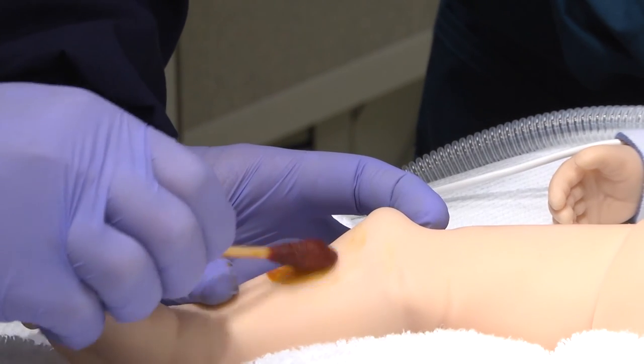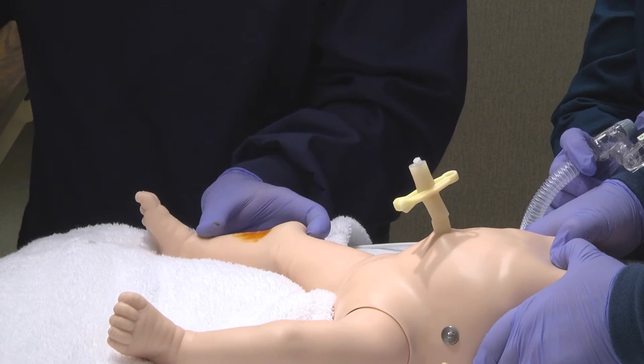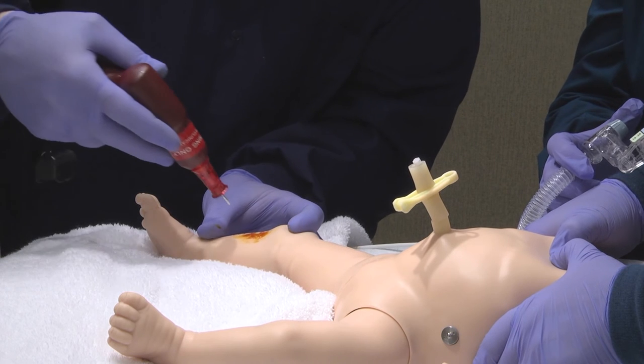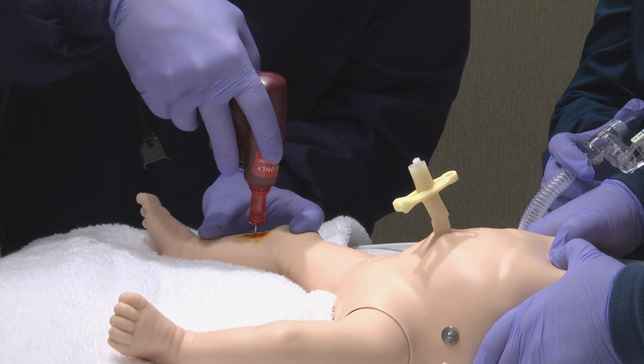Quickly clean the insertion site with antiseptic solution. CPR would be in progress. Hold the IO needle perpendicular to the skin and advance the needle through the skin to the surface of the bone. Direct the needle slightly away from the knee to avoid the growth plate and advance the needle through the bone cortex into the marrow space.